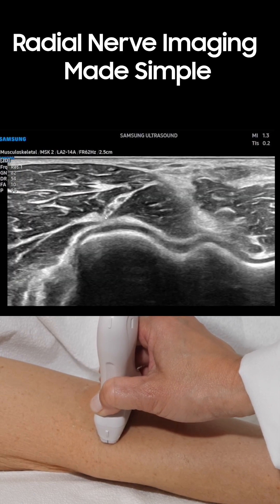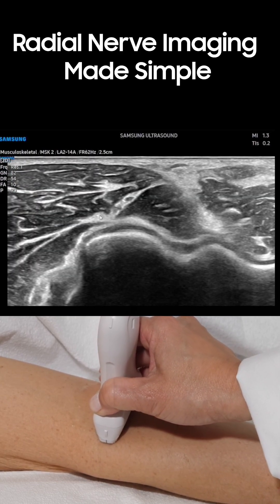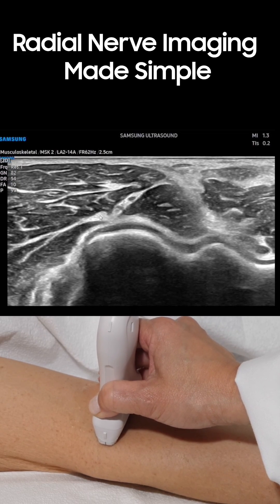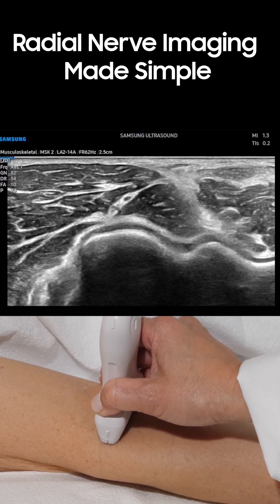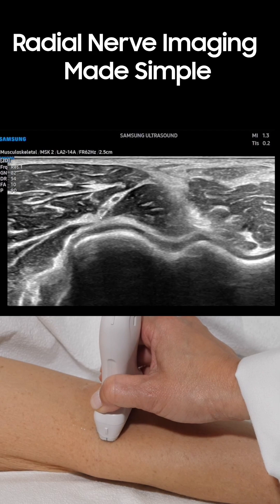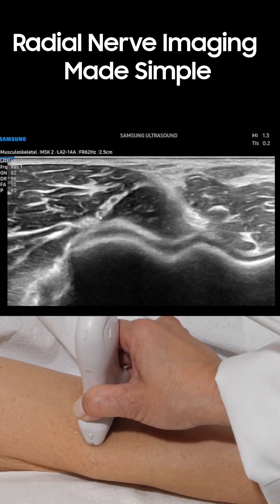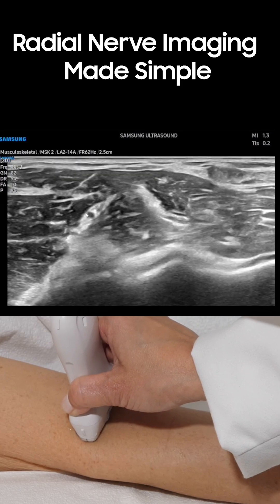This is a portion of my lateral elbow examination because pathology involving the radial nerve can mimic pathology involving the common extensor tendon and other structures in the lateral elbow. So identifying the radial nerve, we see it as almost like a football-shaped structure here.